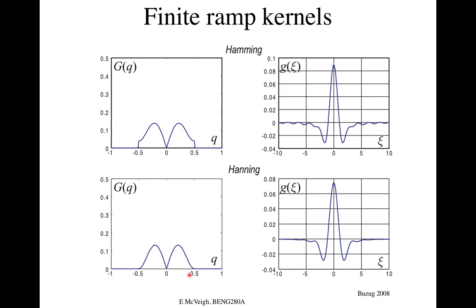And if you were looking for a big blob, then the Hanning is fine. It also turns out that radiologists will ask you to set these filters differently if they don't like the feel of the picture. Oftentimes, when radiologists are looking for things, their comfort at looking at the picture is important. And if the picture looks really hashy and they don't like it and they're not confident in it, then it's better to smooth it. And they'll tell you that.